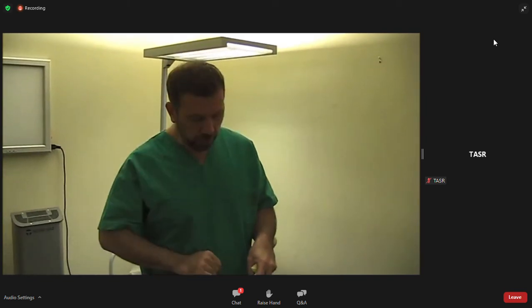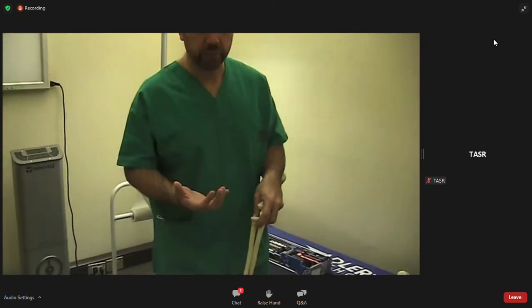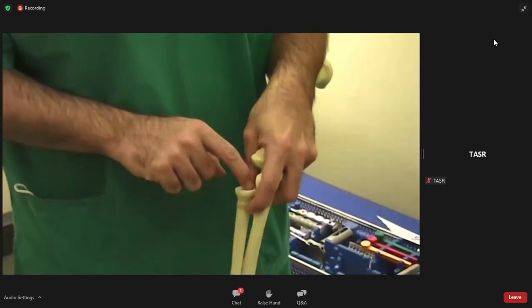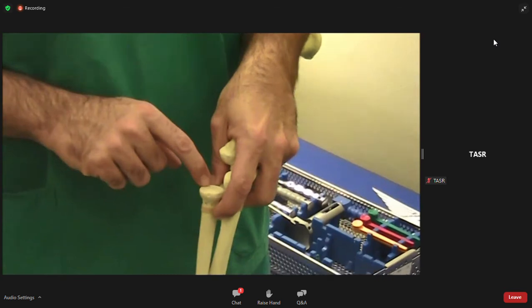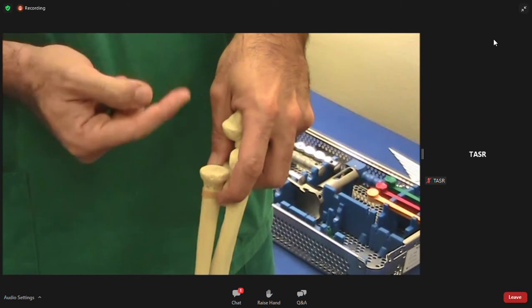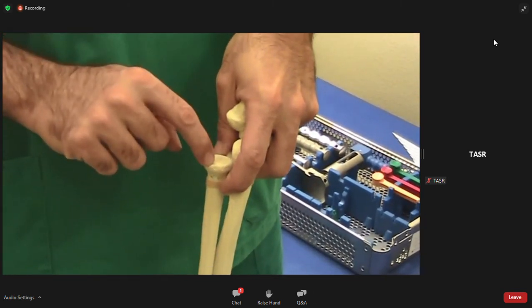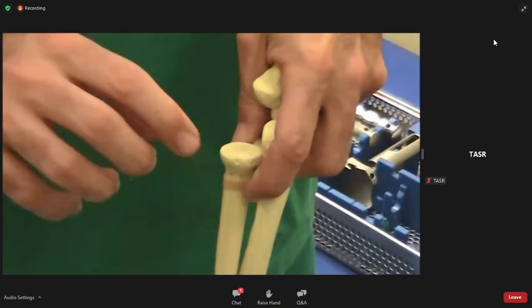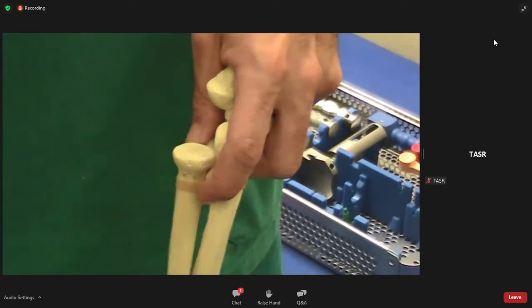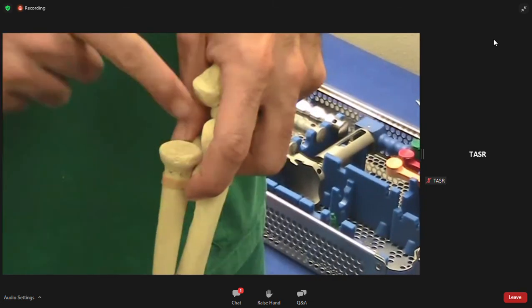So what I suggest you is to, if you have one piece, of course if it's fractured it's different, to design the inner circle, so the inner portion of the cartilage that goes into contact with the capitellum. So you design the inner one, you design the external one or the smaller diameter one, and you probably want to take a dimension that is in between these 2. But by definition, I would not accept in my hands to replace a radial head using the biggest diameter, because it's going to be the biggest you can.